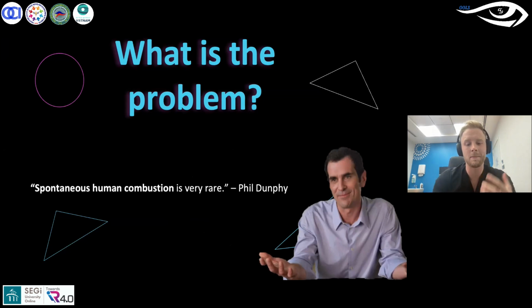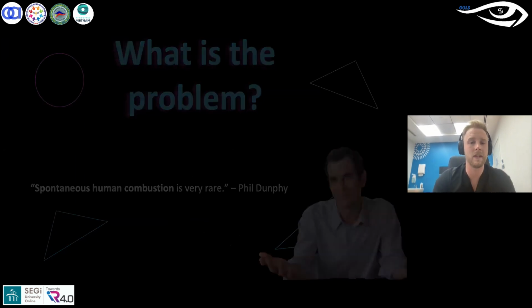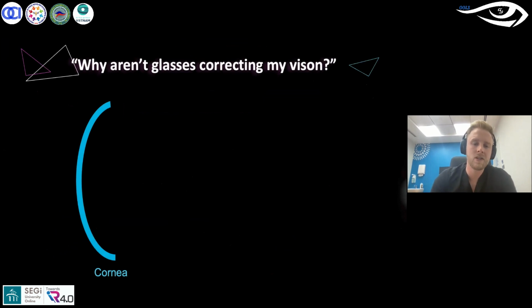And then I would go into explaining to the patient why their vision isn't clear. As practitioners, we know this, but what I would encourage everyone that sees a keratoconic patient is to take out a piece of paper and draw a diagram similar to what I'm going to explain to you today. It takes 2 seconds, and you would be amazed by the amount of patients that have had keratoconus for decades and don't understand why glasses aren't perfectly correcting their vision.